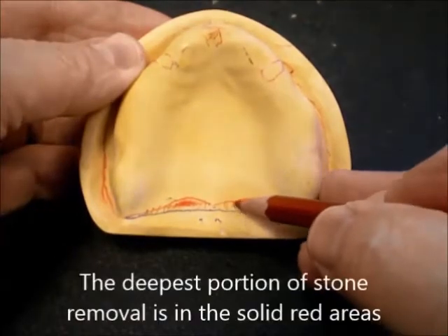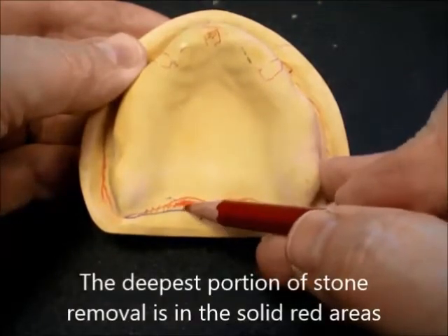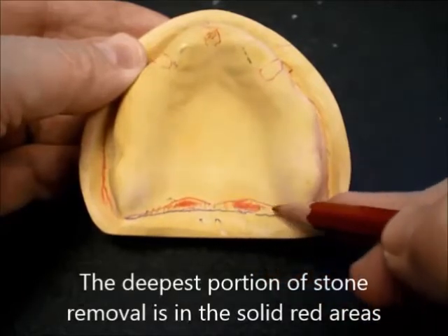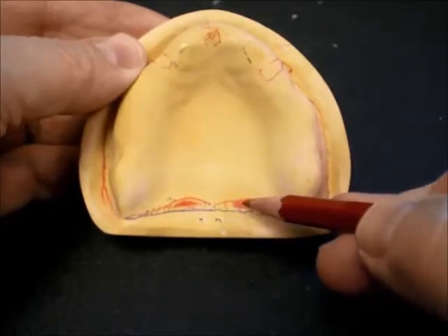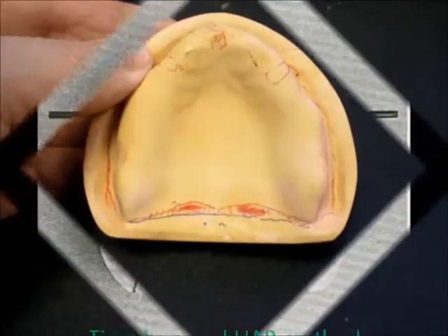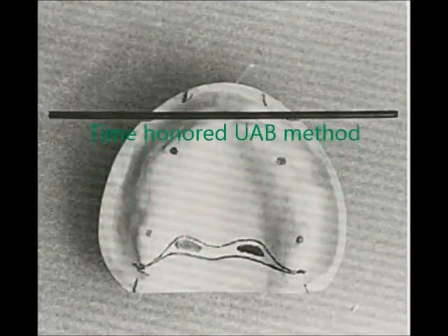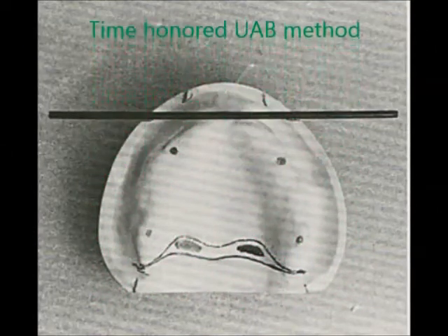The deepest portion is marked in solid red. The width of this area is maximally about 3 mm, and the depth is about 1.5 mm. The exact dimensions are noted in a companion video, although the dimensions are somewhat arbitrary.